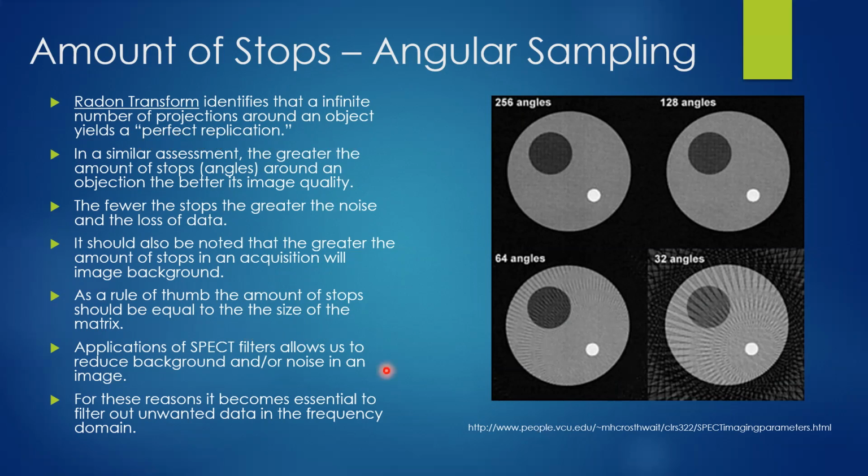And then the other thing that I have here in the very last point, right down here, for this reason, we also want to use things to filter what's going on here, what we refer to as the frequency domain, which I'll talk about in just a moment or two, where we try to eliminate background and noise.